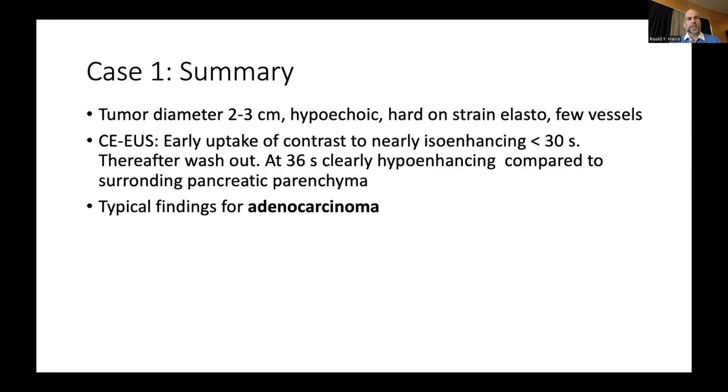With contrast-enhanced EUS, we see early uptake of contrast to nearly iso-enhancing less than 30 seconds, and thereafter we see a washout. And at 36 seconds around that time, we see clearly a hypoenhancing tumor, and these are typical findings for adenocarcinoma.